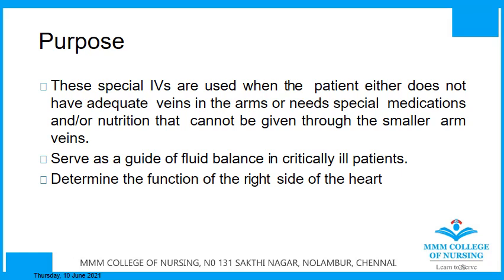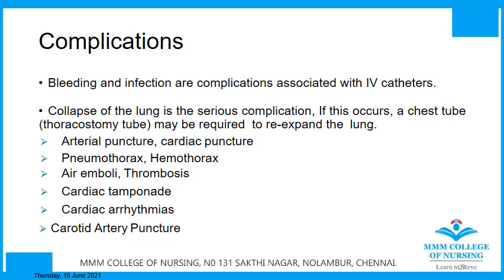Second thing, it serves as a guide for fluid balance in critically ill patients. And third, it is to determine the function of the right side of the heart. So these are the purposes of central venous catheter. Let's see what are the complications.